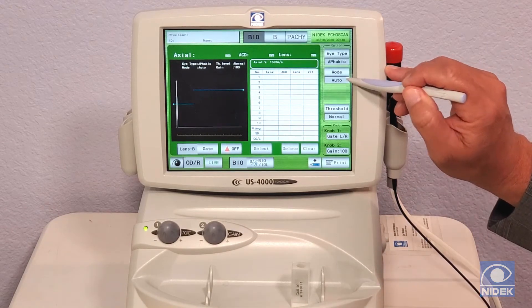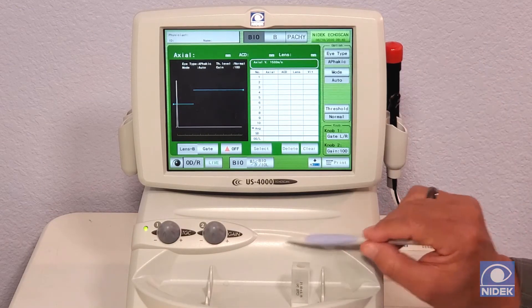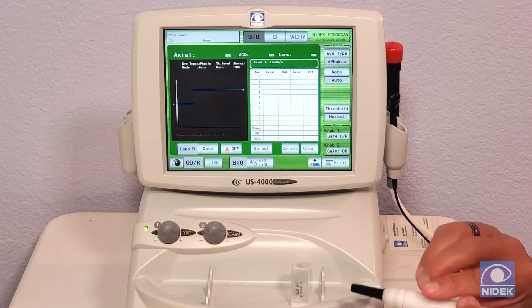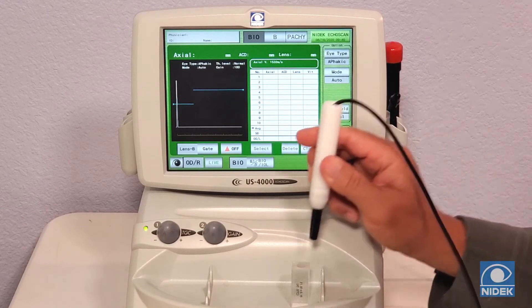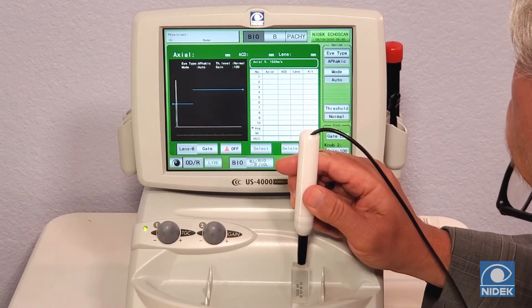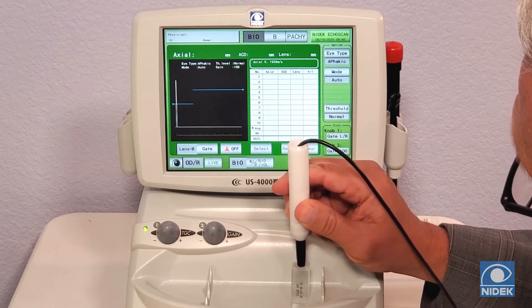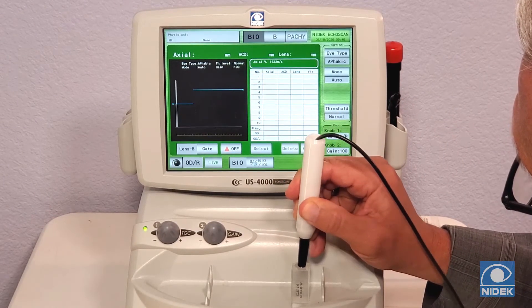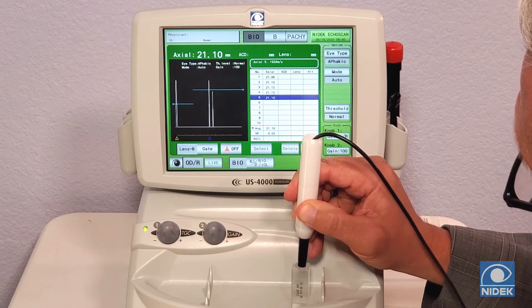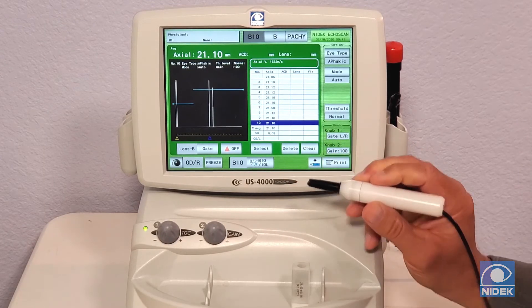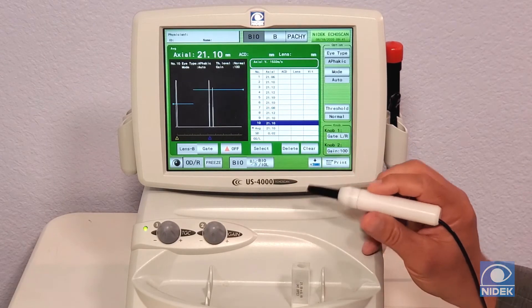We're going to stay in auto mode, which is going to automatically give me 10 measurements. I'll place the A-scan probe on the jig, and it's going to give you your 10 automatic measurements.